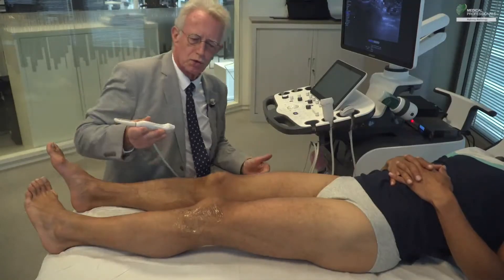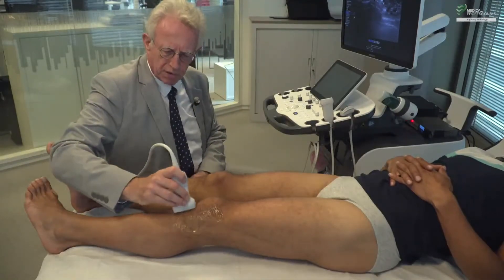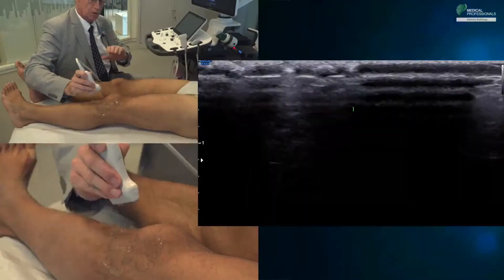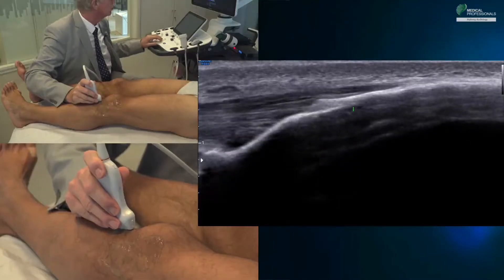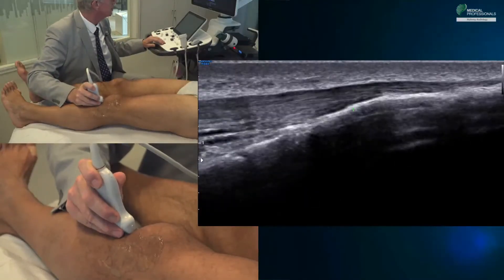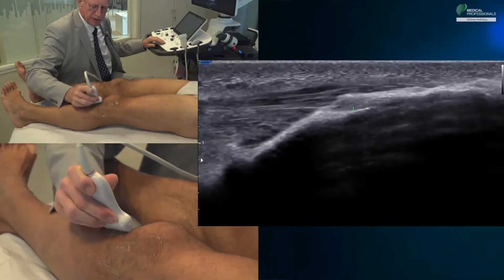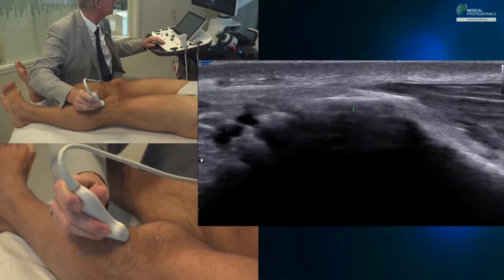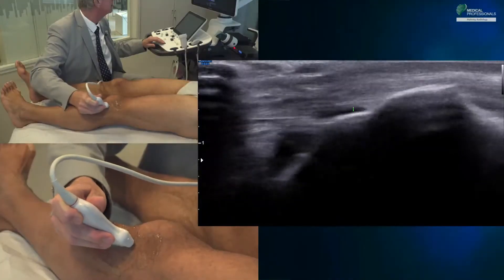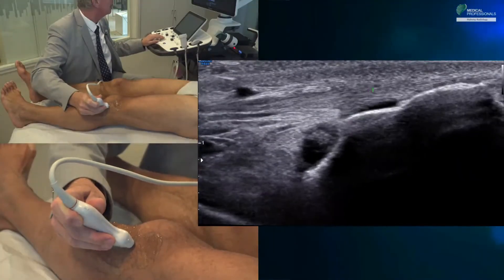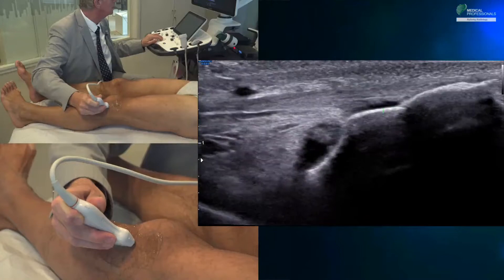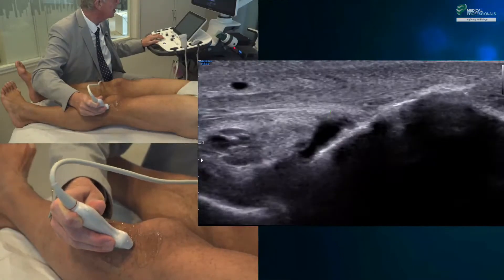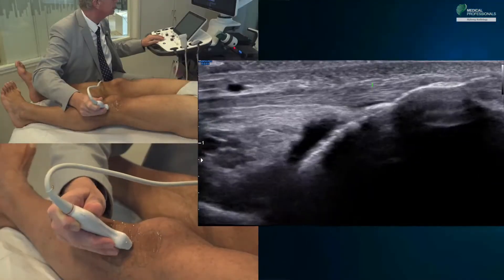Let's see how to practically analyze the lateral part of this knee. To begin with, we study the iliotibial band. To locate it, we start from the patellar tendon/ligament and slowly translate the probe sideways. The first structure we find is the iliotibial band — we can see it perfectly here, its insertion on the tibia, with a little distension and a normal small bursa.